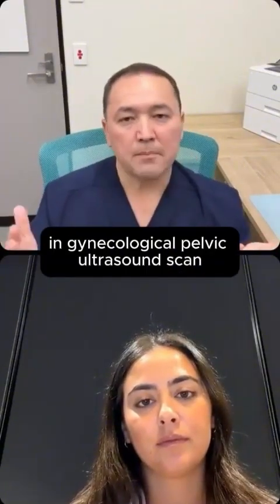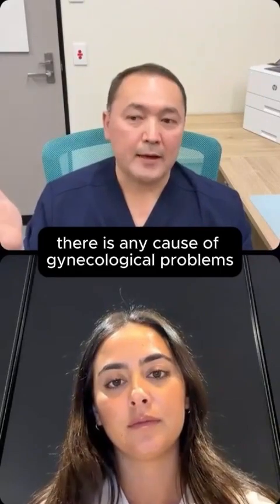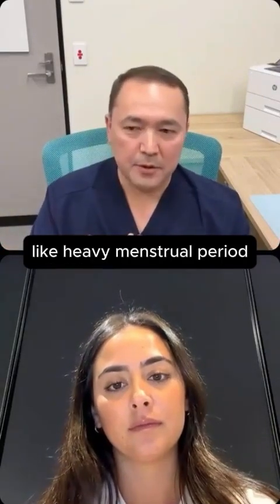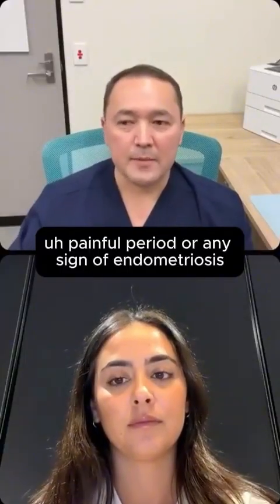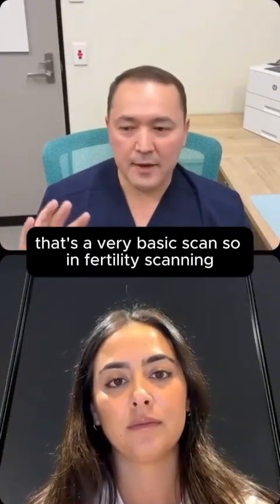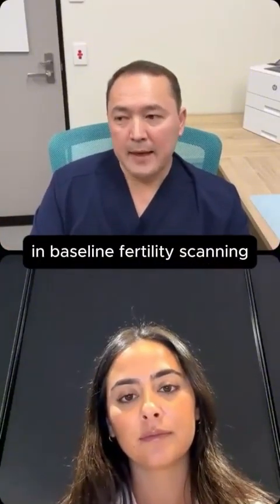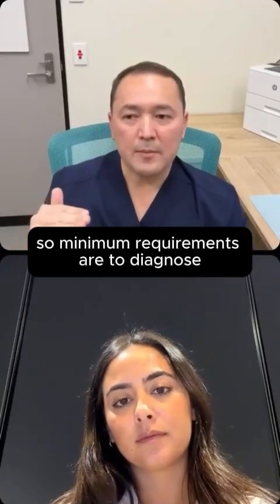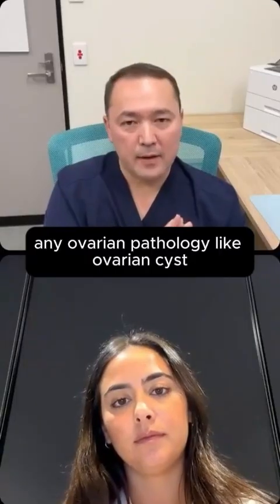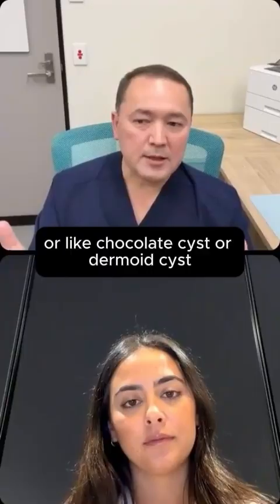In a gynecological pelvic ultrasound scan, essentially the sonographer wants to find out if there is any cause of gynecological problems like heavy menstrual period, painful period, or any sign of endometriosis, ovarian cyst. That's a very basic scan. So in baseline fertility scanning, we have a minimum requirement. The minimum requirements are to diagnose any ovarian pathology like ovarian cyst, chocolate cyst or dermoid cyst.